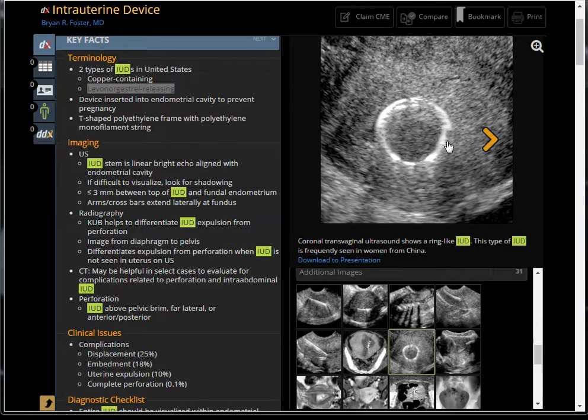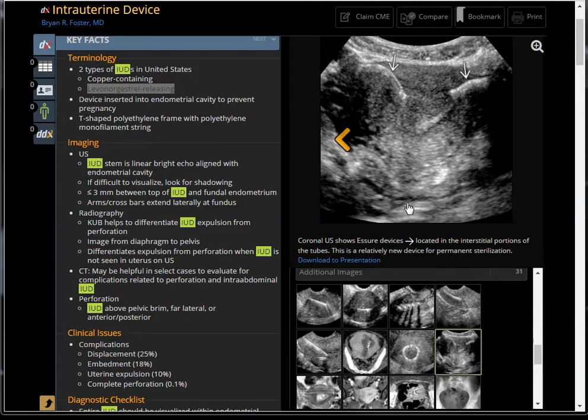In China, they use a ring-like device for IUD. There is also a newer device called the Essure device — a small string that plugs the cornual and extends into the fallopian tube, literally blocking the path of sperm to meet the egg. This is a device for permanent sterilization. It appears echogenic with not much shadowing.